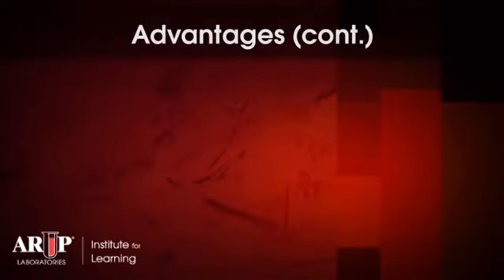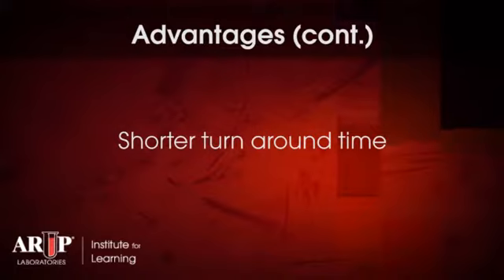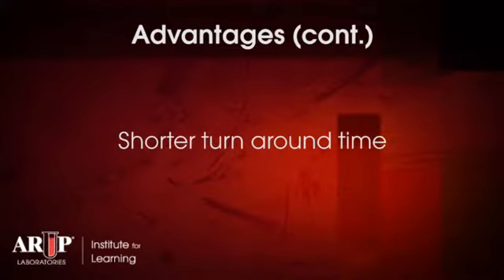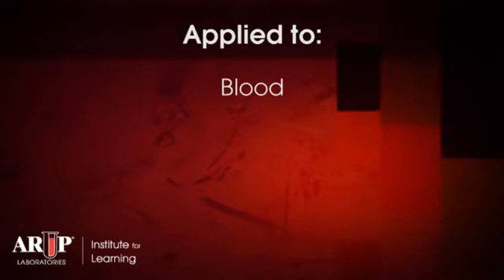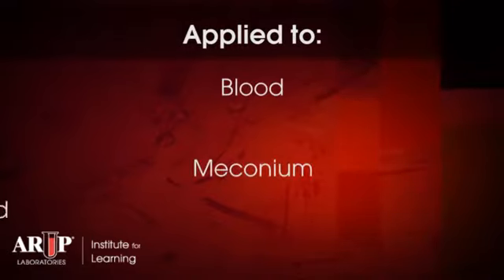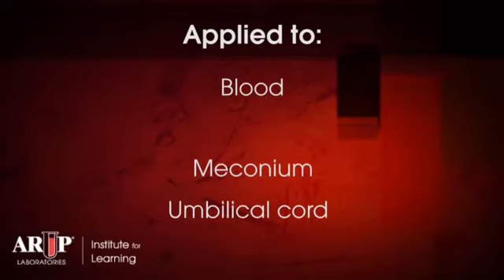Another potential advantage to the time of flight is the shorter turnaround time because the secondary testing or confirmation testing is not required. This approach has been applied to blood, urine, meconium, umbilical cord, and potentially other specimens as well.